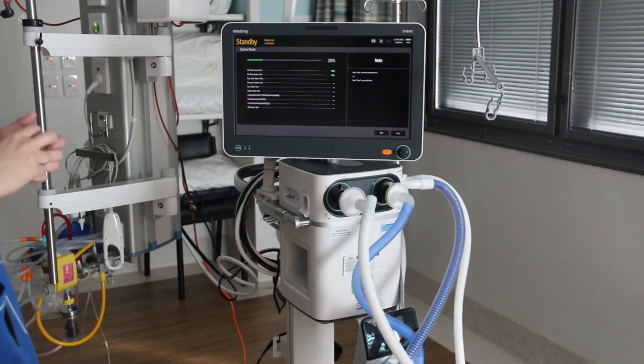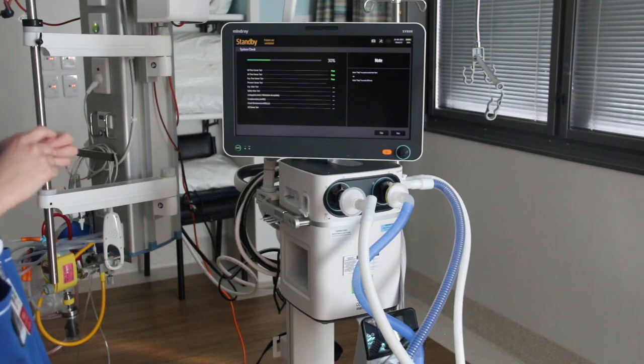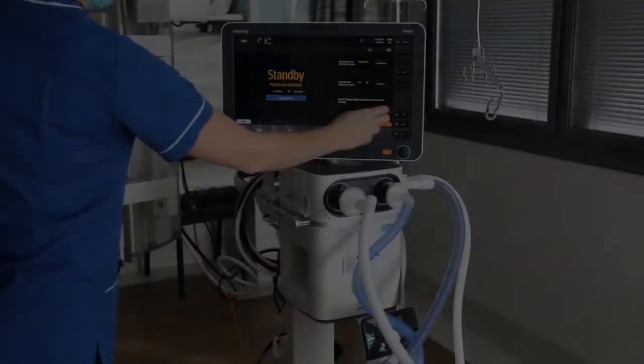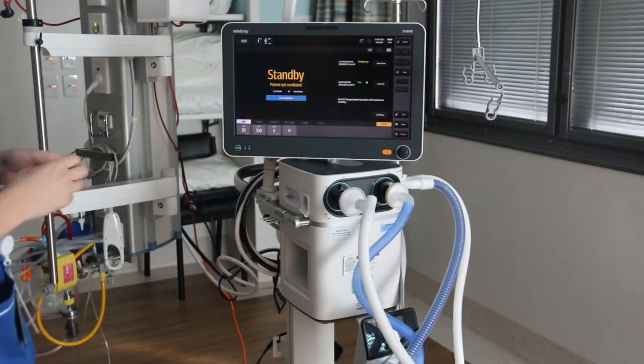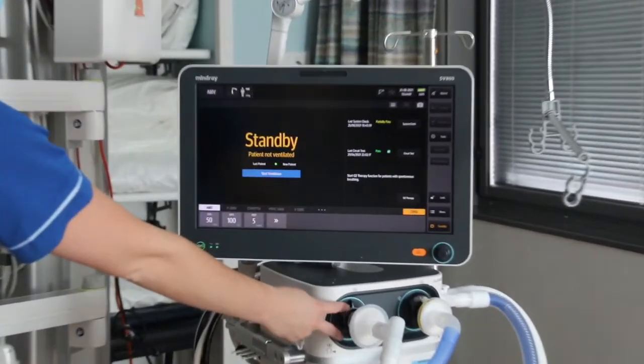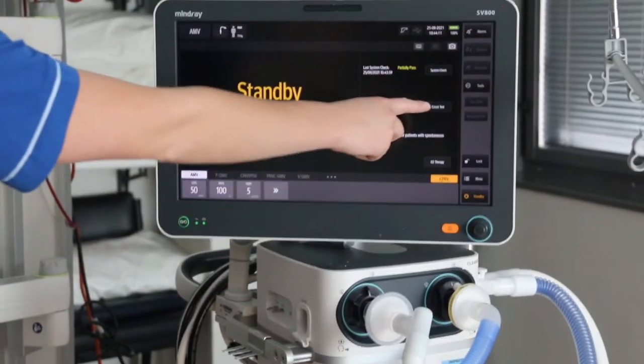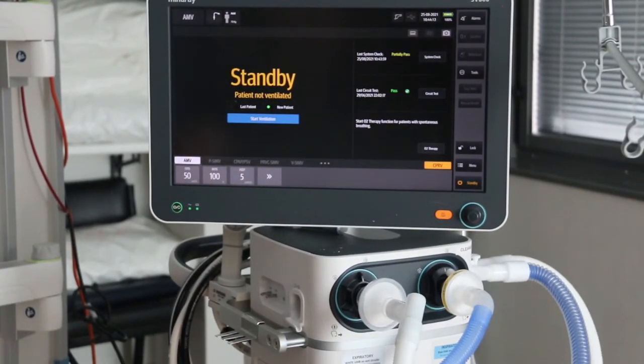Once this calibration system check is finished, your ventilator is ready to use provided it passes. If you need to change the tubing between patients, there's another option on the main screen for circuit test. If you just need to change the circuitry between patients but you're not changing your exhalation valve and flow sensor combo — if you're just changing the circuit — you can do this shorter circuit test which only takes about 30 seconds.